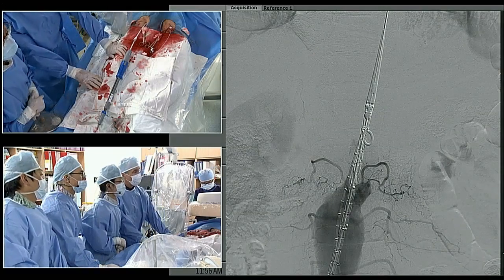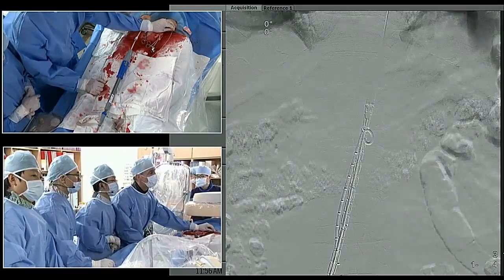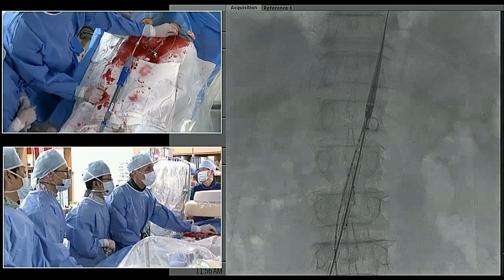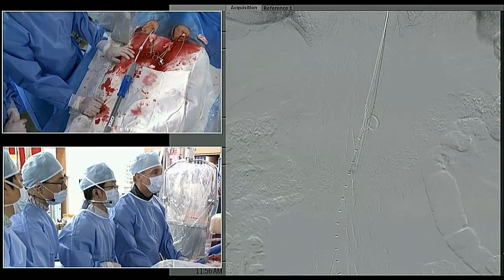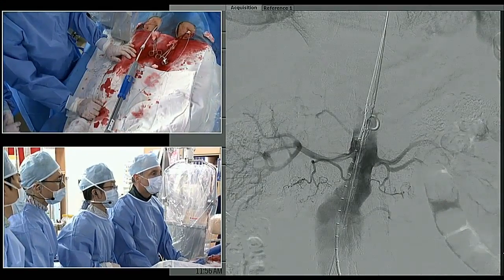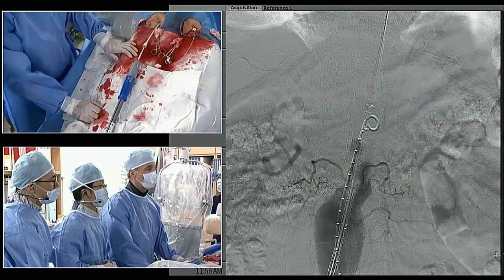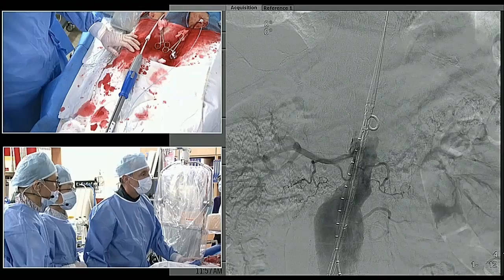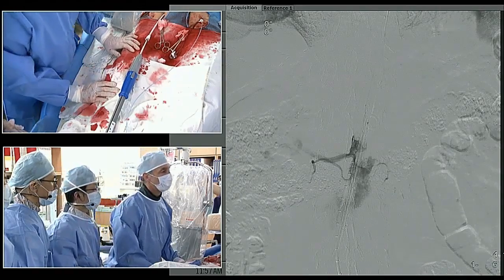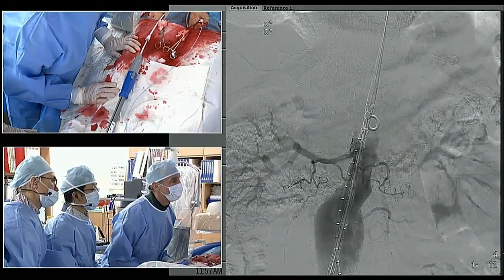Didn't feel the left there. Hold on. Let's try that again. Okay, here we go. So this is probably a reasonable place. I think, Bob, you can see the markers there for the fabric right at the pigtail. Right?